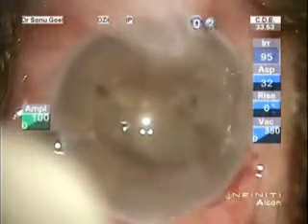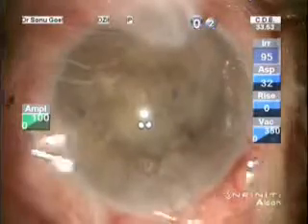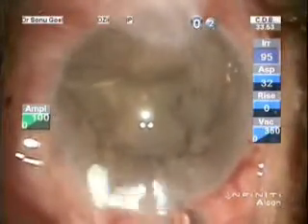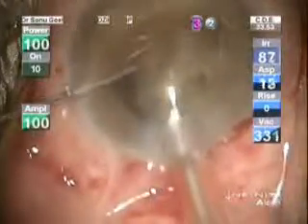This is yet another case where during the surgery we realize that there is a posterior capsular breach. The nuclear fragments are brought into the anterior chamber, and this hydrophilic acrylic foldable is gradually pushed in. Care should again be taken that the leading haptic goes in the sulcus and the trailing haptic sits on the iris. This prevents the nuclear fragments from falling into the vitreous cavity.